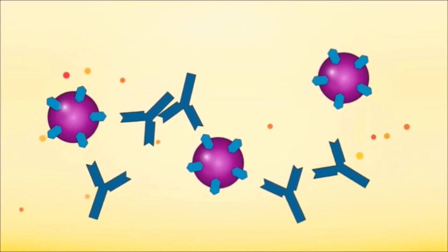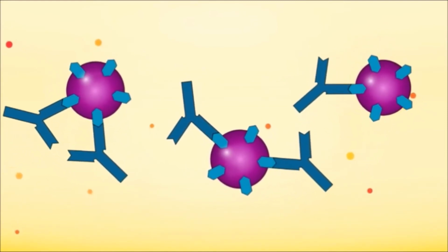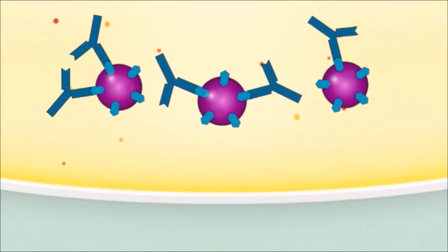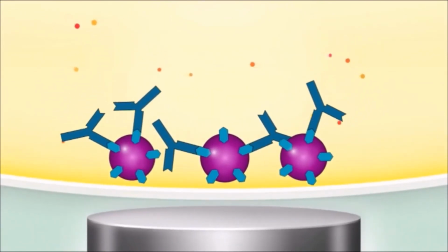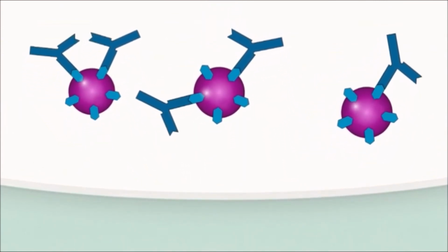antibodies present in the sample bind to the beads, creating the initial antigen-antibody complexes. The unwanted residuals are removed by a process known as the magwash. To accomplish this, the magnet attracts the antigen-antibody complexes in the cuvette. The plasma and residuals are then automatically removed. The magnet retracts, releasing the antigen-antibody complexes.